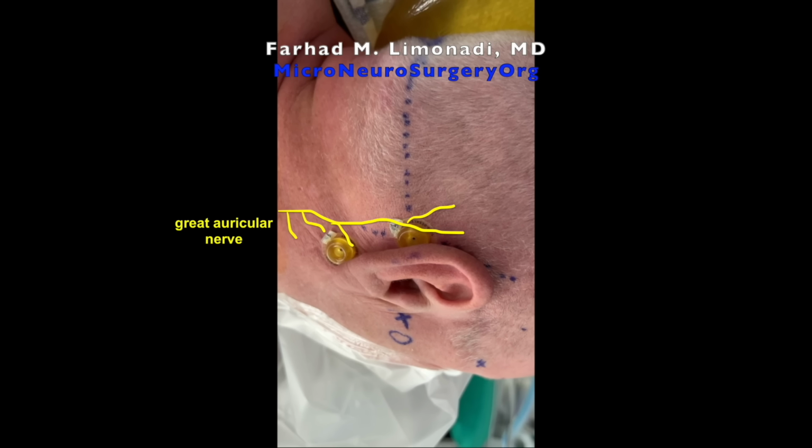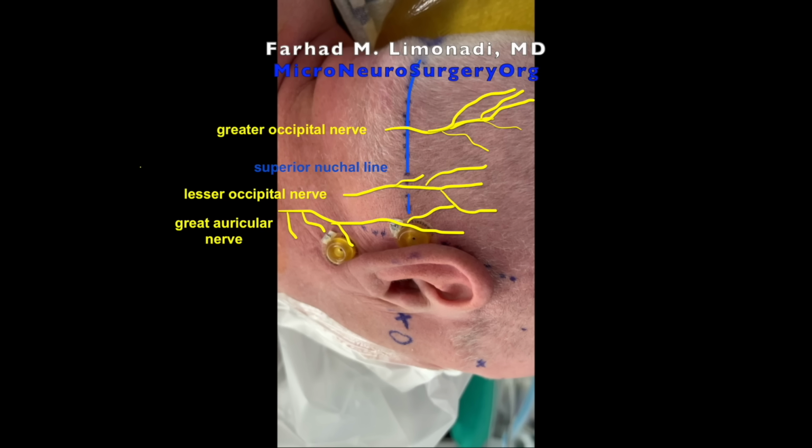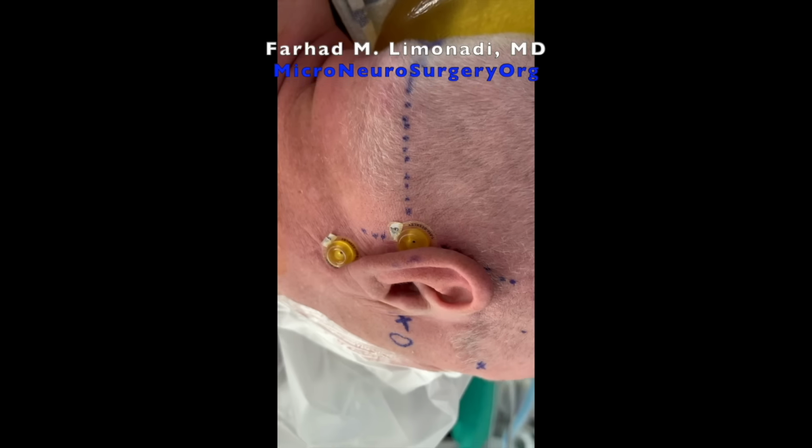To block great auricular nerve, inject the local anesthetic about 2 cm posterior to the auricle or ear at the level of the tragus. To block the lesser occipital nerve, infiltrate local anesthetic subcutaneously behind the ear, starting from the top down to the auricular lobule, and then continue to infiltrate along the superior nuchal line. Greater occipital nerve is found about 3 to 4 cm lateral to the external occipital protuberance along the superior nuchal line.